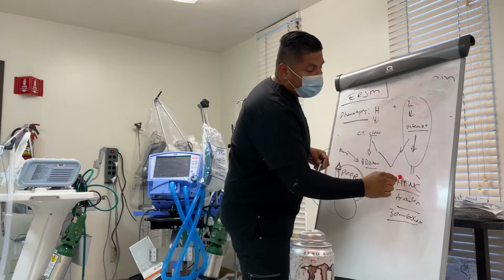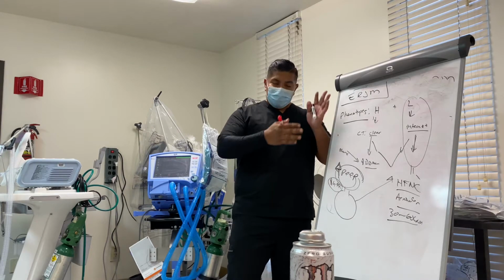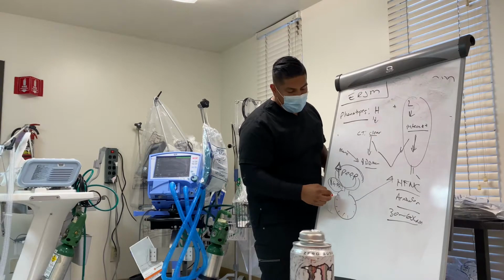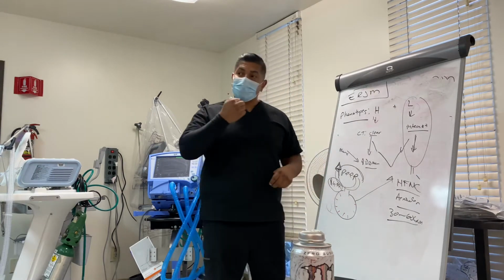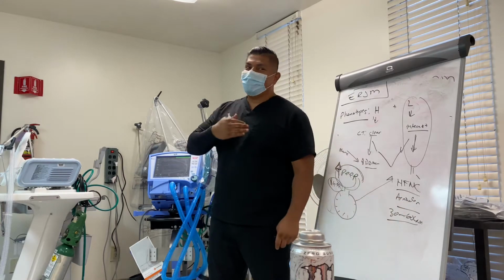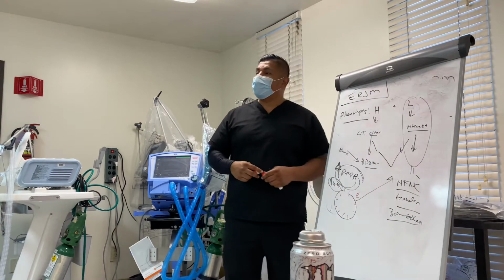So we want to introduce some sort of PEEP to minimize the shearing effect on these patients. I'm working backwards, but we want to minimize the shearing. You do not at this time want to introduce any type of nebulizer therapy or metered dose inhalers, because the word aerosol is a no-no. And you want to introduce some type of steroid to minimize that swelling.